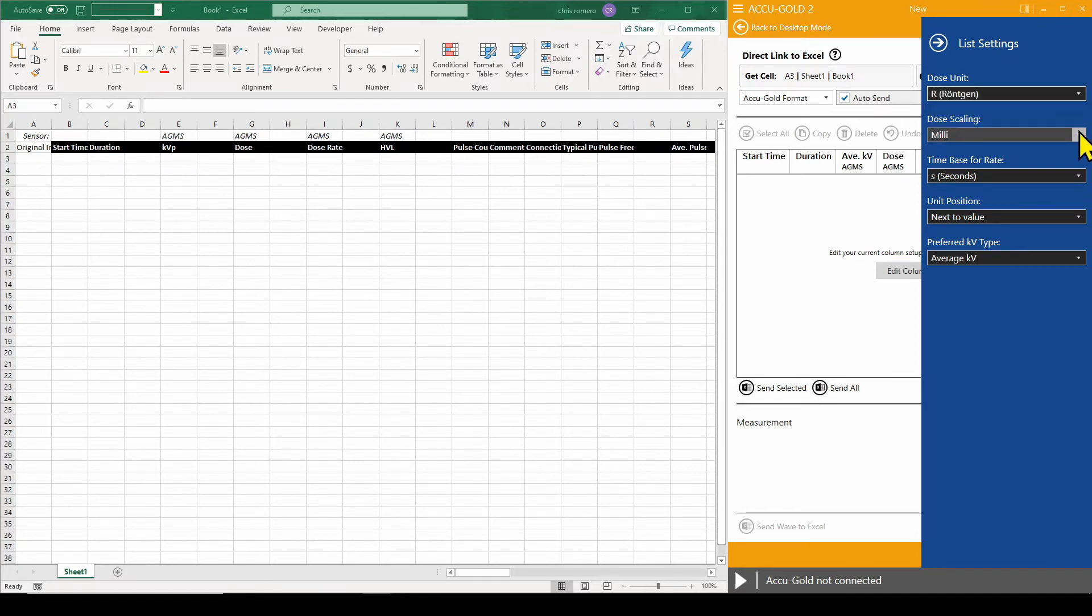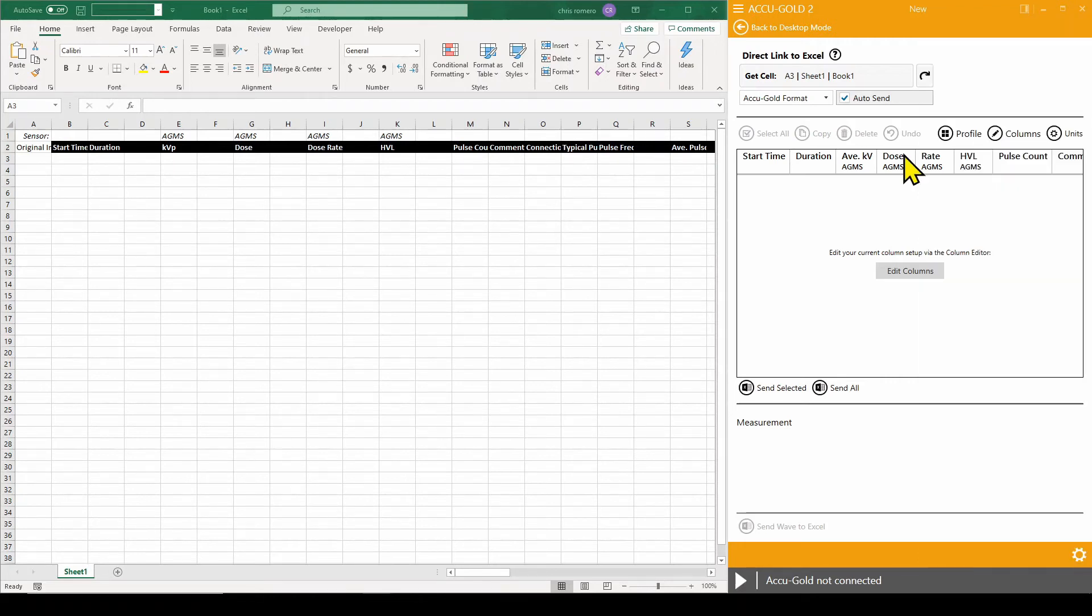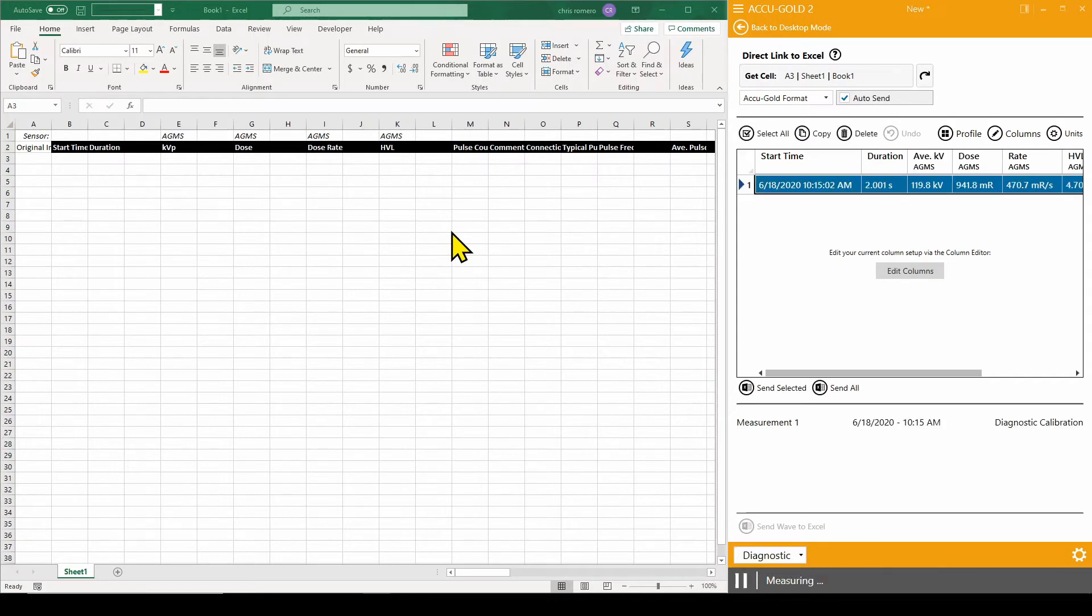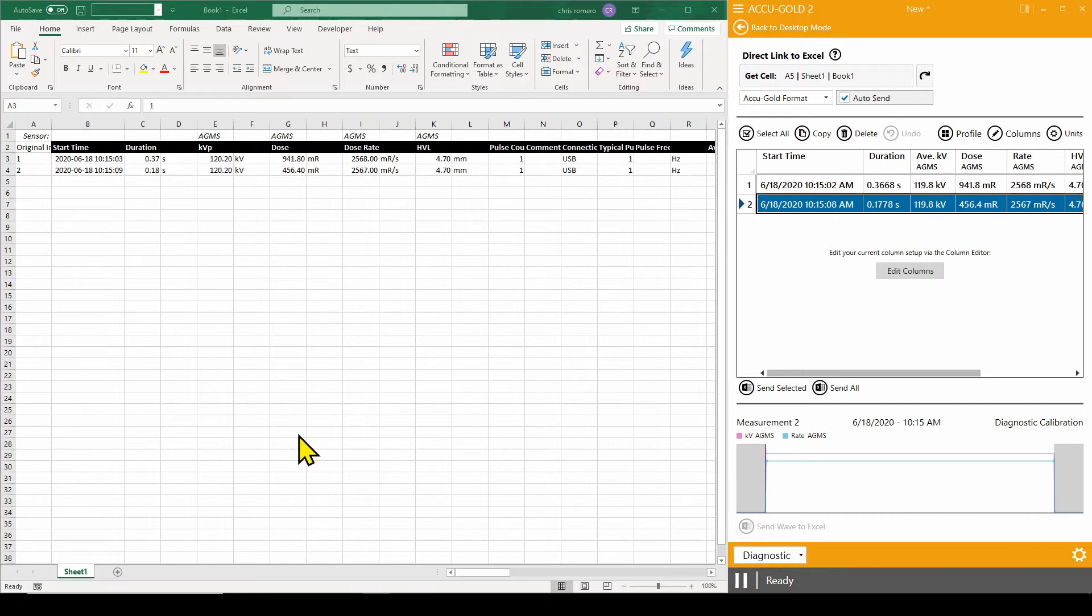Now that companion mode is ready for use, you can begin measuring to collect data. Data outputs can be linked to any cell in a template by selecting the destination cell and creating a cell reference to the data sheet if you are creating a report.